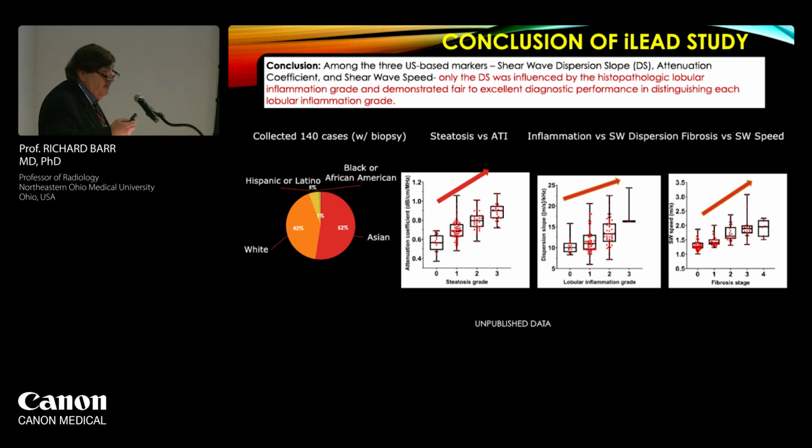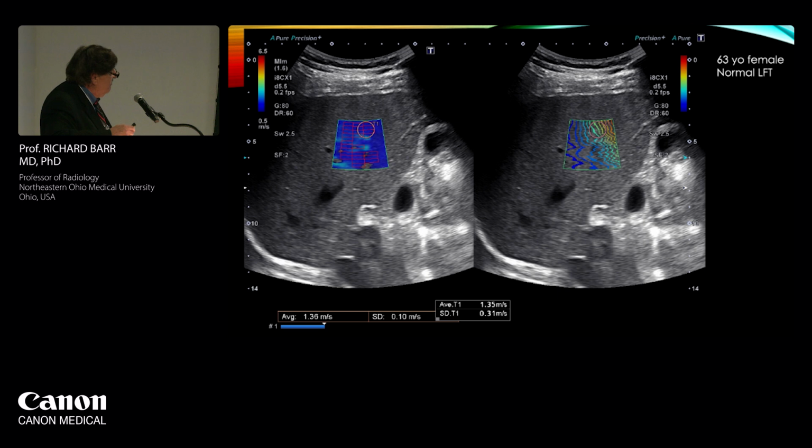And again, we have several papers now that show that using the Canon system, the SRU guidelines work perfectly, and we're very happy that they did that, and we're hoping all the other vendors will move to do that.